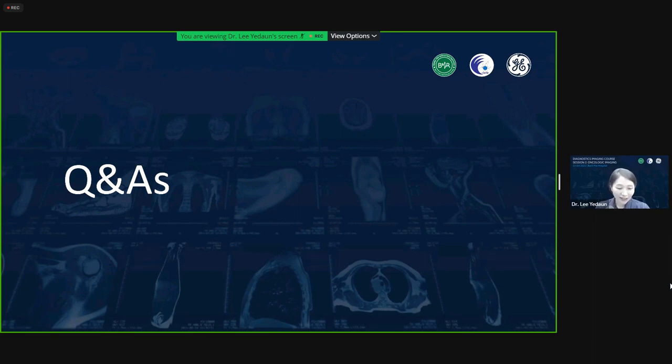So if we can confirm the image quality with the help of other techniques such as deep learning reconstruction or spectral images, I can use low dose CT for HCC diagnosis. But until now, my institution cannot use deep learning reconstruction for low dose CT, so I do not use low dose CT.